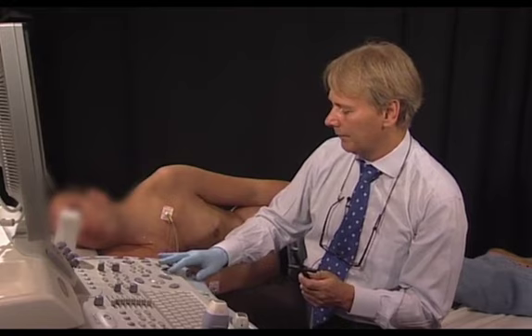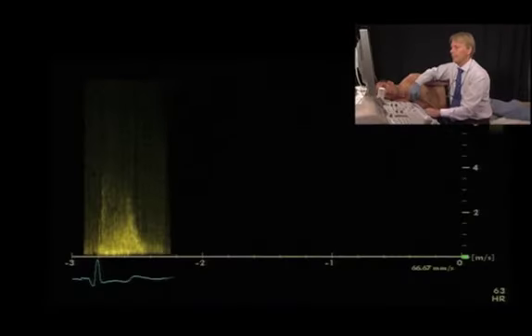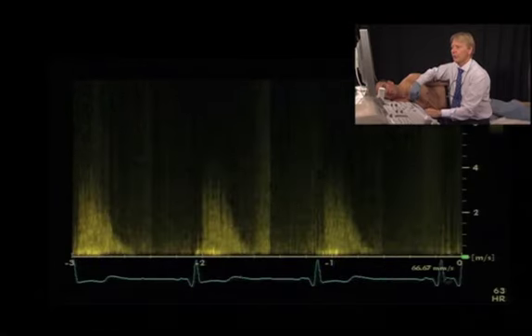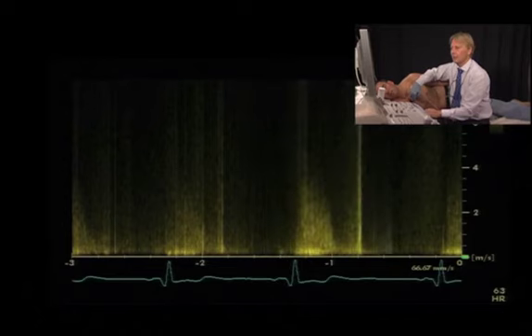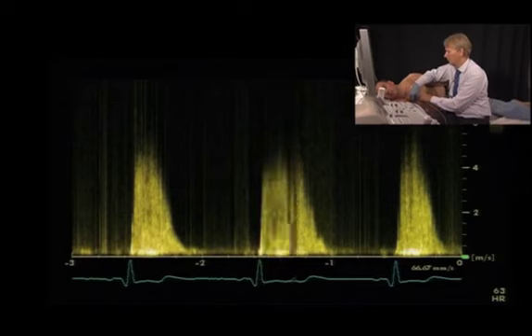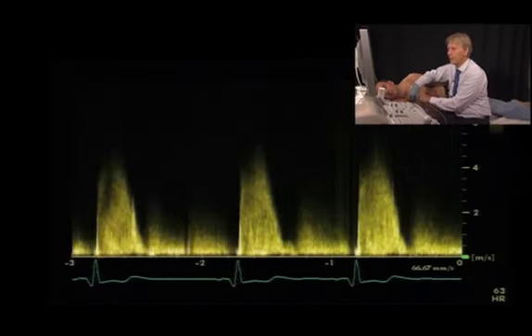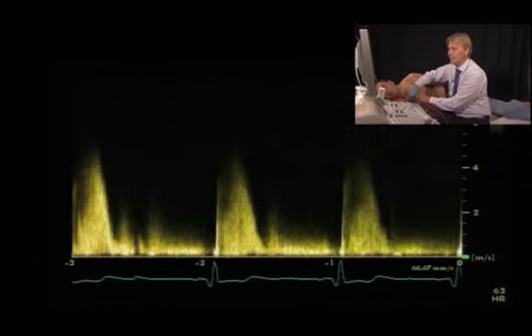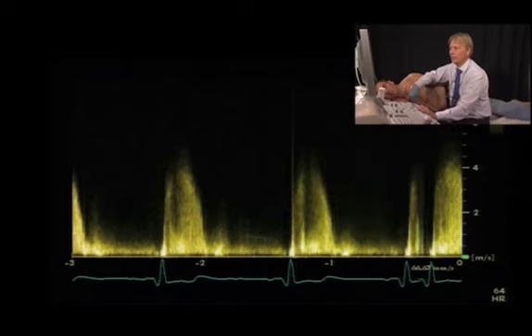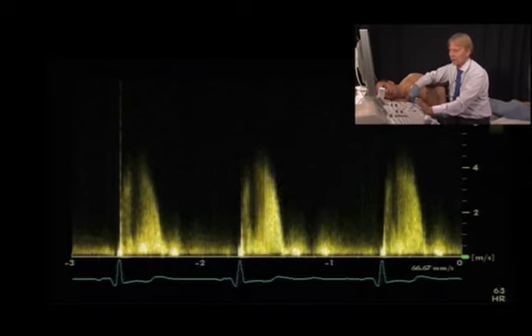So we'll start with a position where we're located in the third intercostal space. So in here we see a signal which is the aortic valve, but not in a very good quality. So I will now tilt the transducer more cranial, and the signal improves. Small motions, and the velocity is somewhere in the region of maybe 4.5 meters. But we do not know if this is really the maximal velocity.